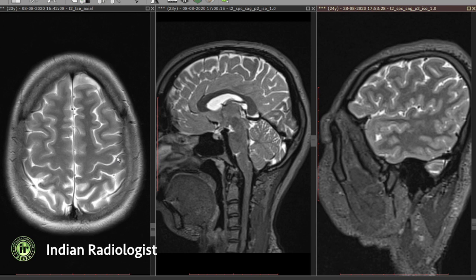So how do we identify the central sulcus? On axial imaging, we first identify the superior frontal sulcus separating the superior and middle frontal gyrus. At its posterior limit, it forms a right angle with the precentral sulcus. The next sulcus posterior to it is the central sulcus.